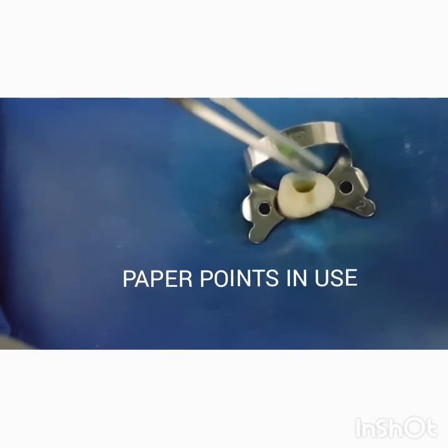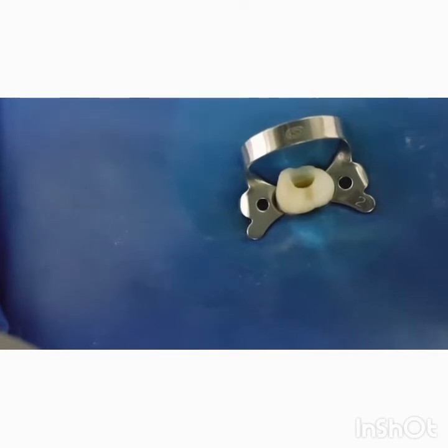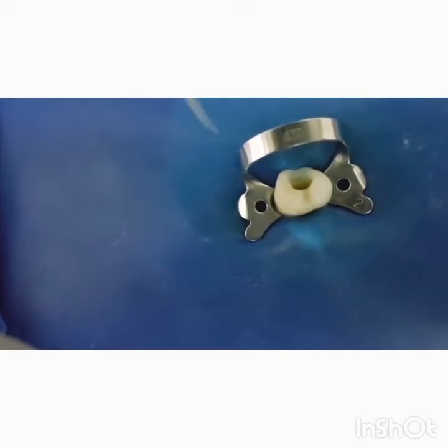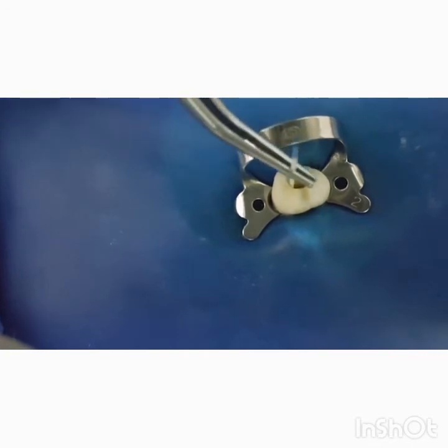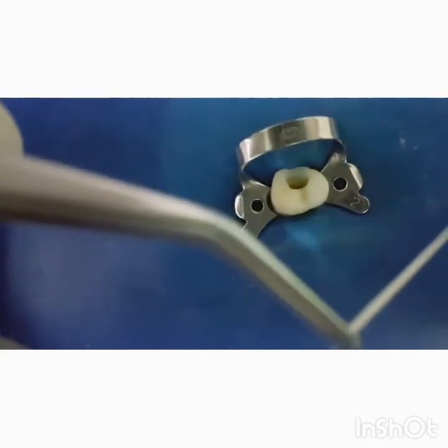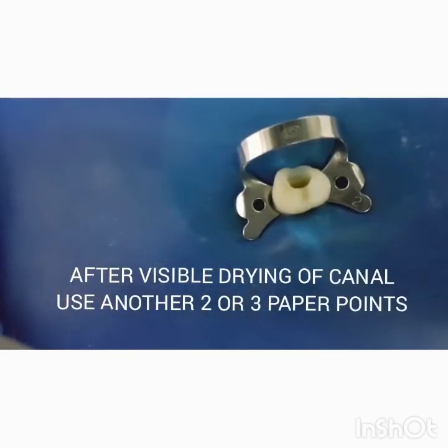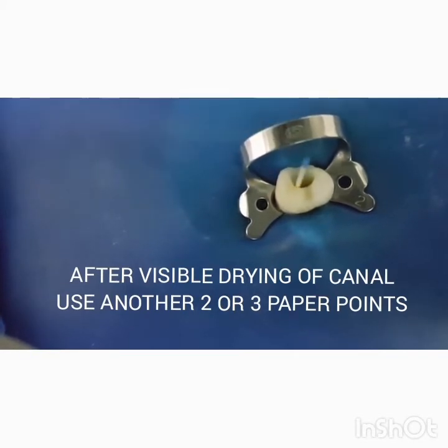After there is visible drying of the canal, which can be confirmed with the help of your paper point, one can further use two to three paper points to ensure complete drying of the root canal.